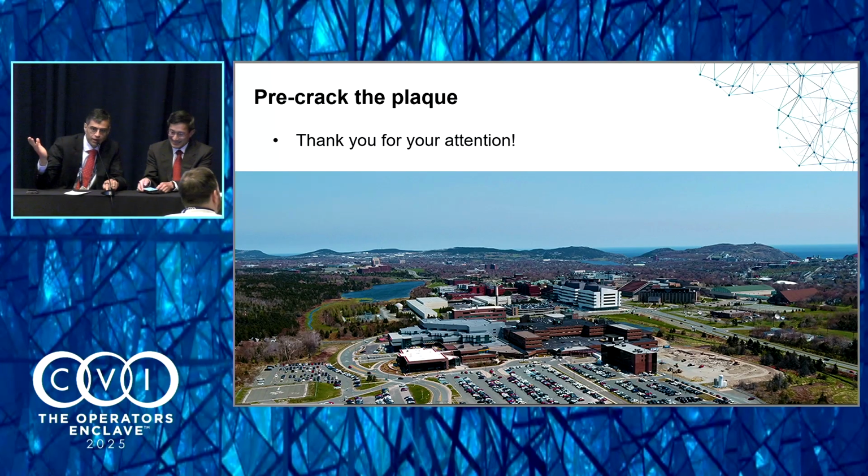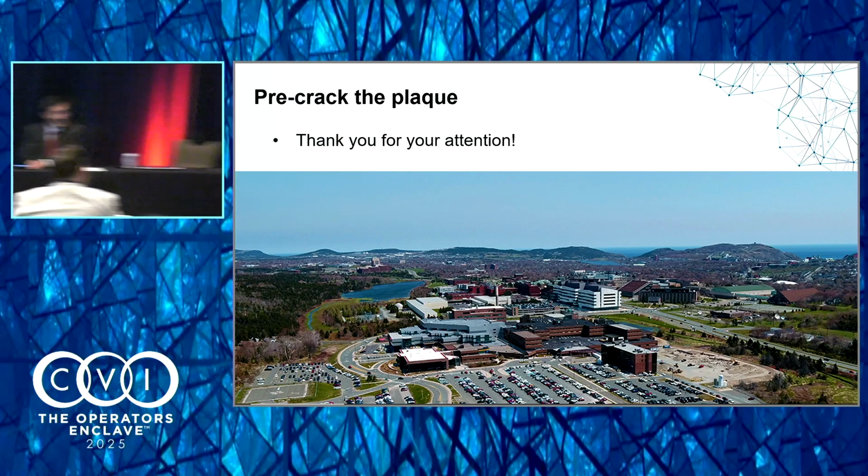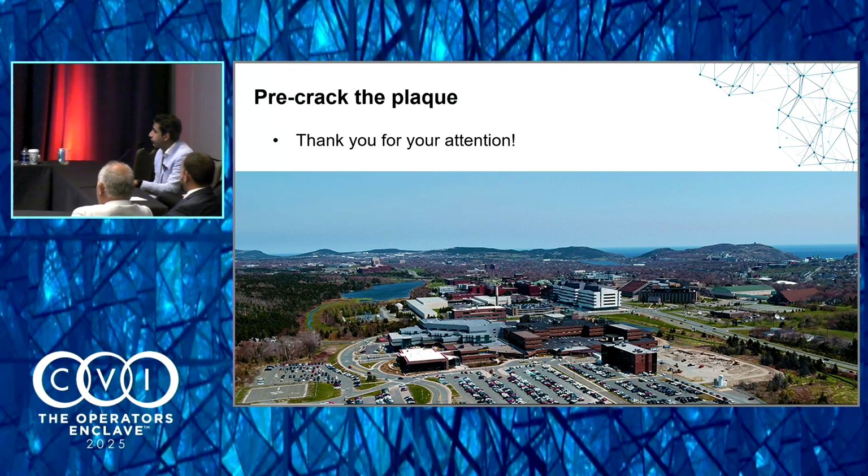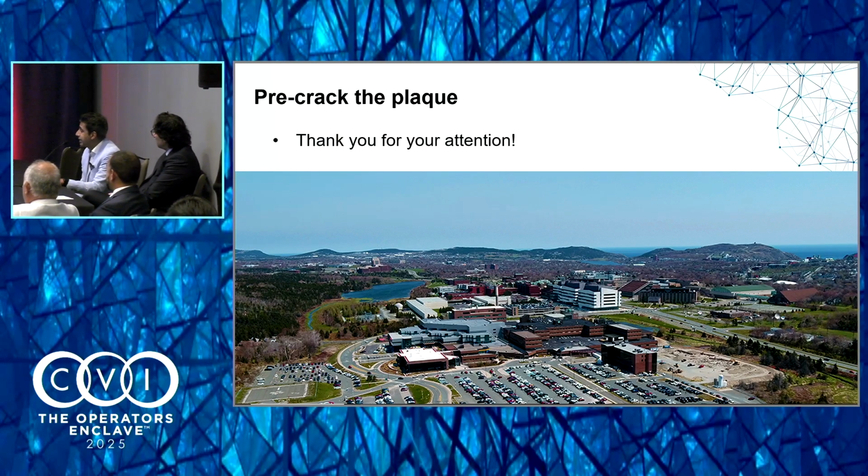This reminds me of the 1.5 Rota. You don't need two Rotas, 1.5 works. Have you used this technique? Is it a Canadian, or is it just a Newfoundland technique at this point? I have not used this technique, but I'm really intrigued. The smallest OPN we have on our shelf is 2.5. So for a number of these lesions, if they don't dilate with an NC, we either use an OPN or Shockwave. But I'm intrigued by this technique, and maybe it'll spur some ideas.